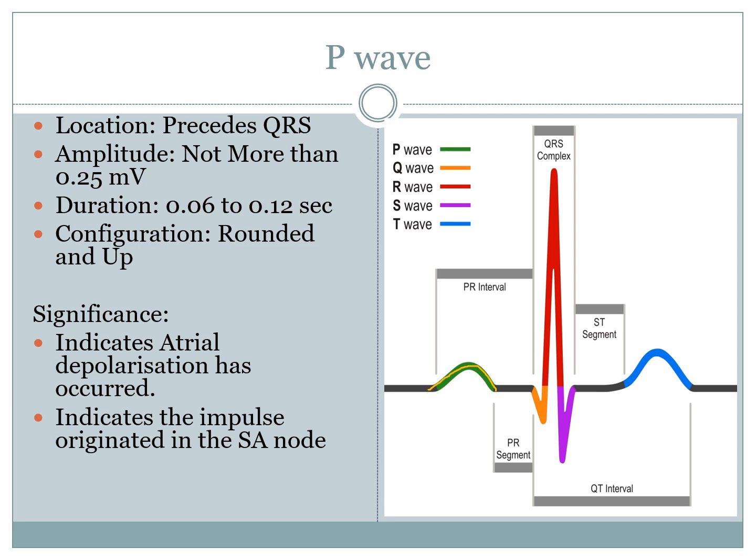the atrium, both atria. So if you were to break the P wave down, and you could see the right and the left atrium contracting individually, you would see two peaks and troughs. Okay, but because they're joined together at the same time, you should see a nice rounded and upright curve of the P wave itself.